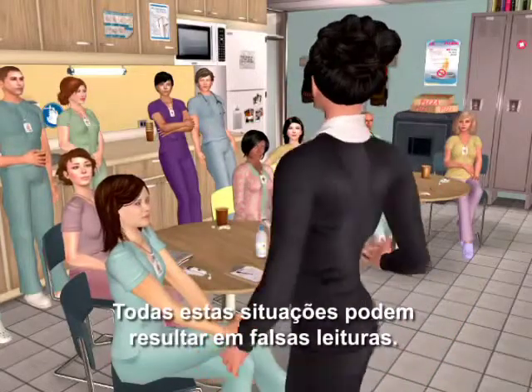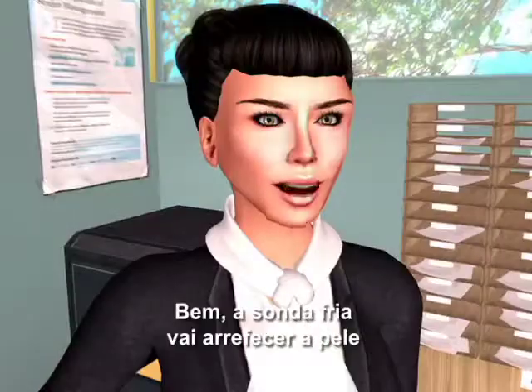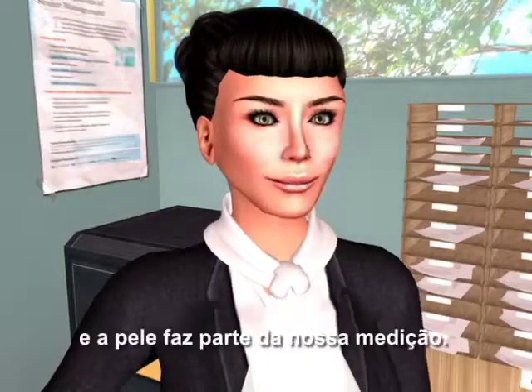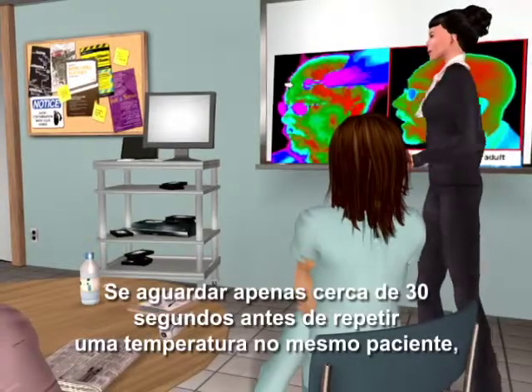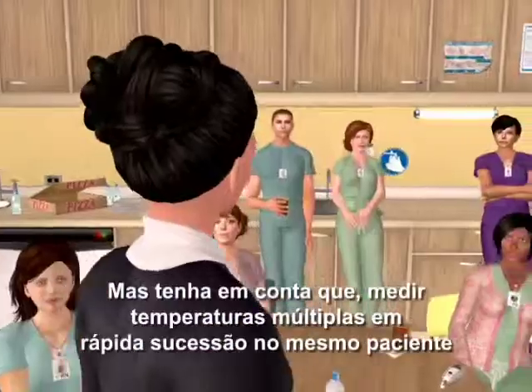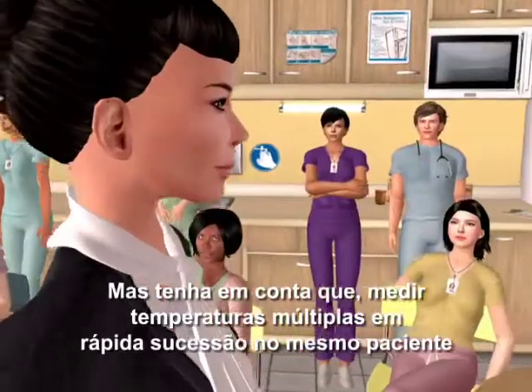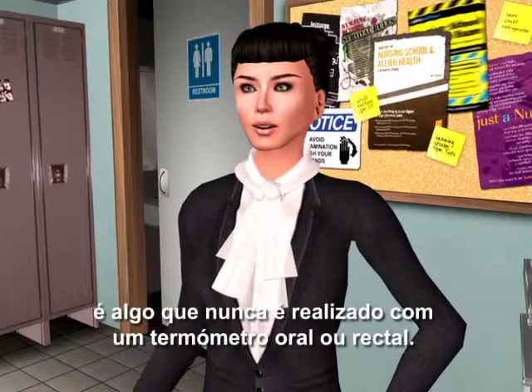All of these can cause false readings. Why are multiple temps an issue? The cold probe is going to cool the skin, and skin is part of the measurement. If you wait about 30 seconds before repeating a temp on the same patient, you'll be fine. Note that taking multiple temps in rapid succession on the same patient is something never done with an oral or a rectal thermometer.